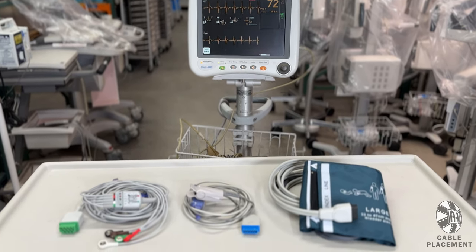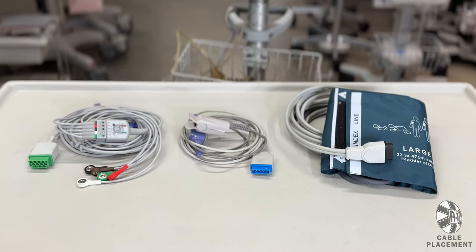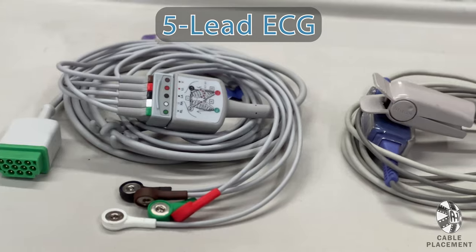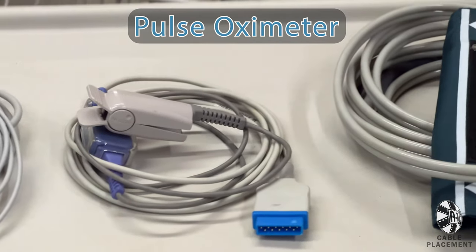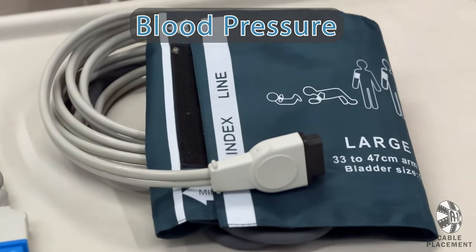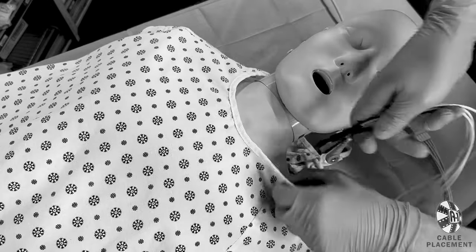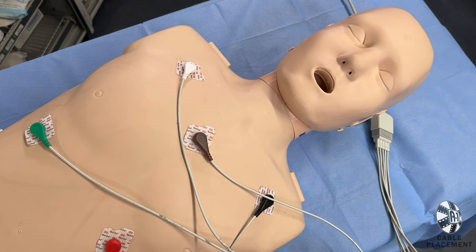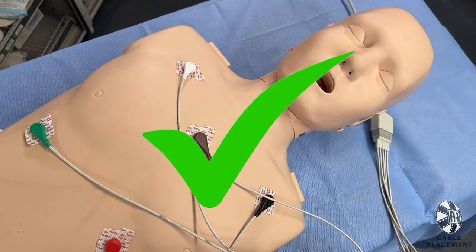Our heart monitors include all the patient cables you will need to attach to your actor. The patient cables include 5-lead ECG, Pulse Ox Finger Probe, and Blood Pressure Cuff. Some folks will simply drape the cables down the patient's gown and call it good enough. But why not learn how to attach everything to your actor the real way?